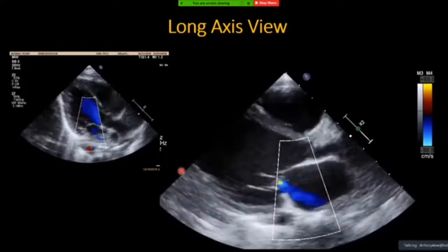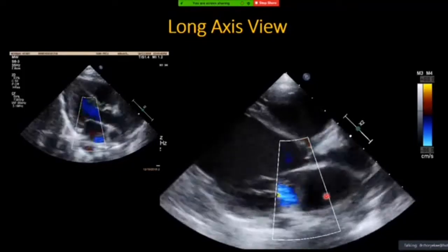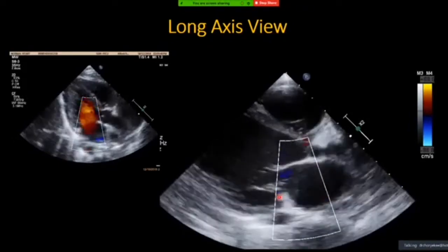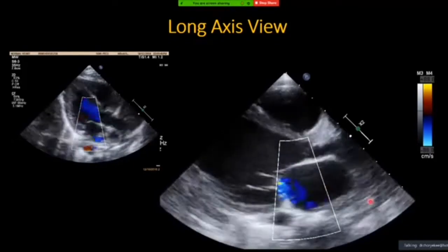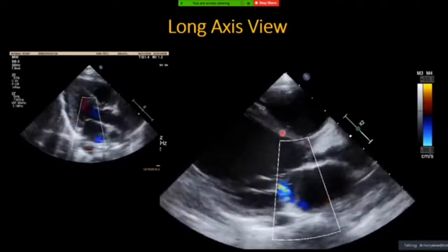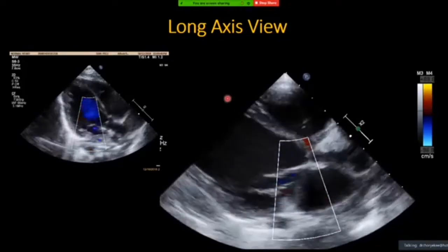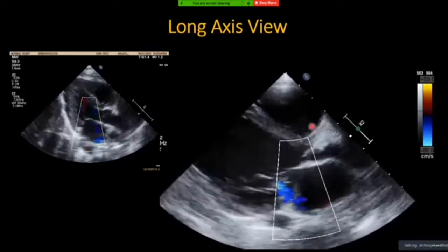So now let's go again systematically for the chamber size. When you look at the chamber size, the left atrial chamber as compared to the aorta outflow, we see that the left atrium is big. And we look at the left ventricular chamber size as compared to the normal, as we said just now, it looks like a cone shape. But this left ventricle is very big, until maybe it is square shaped. Similarly, the right ventricular chamber is also very big.